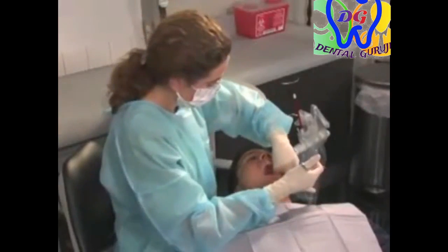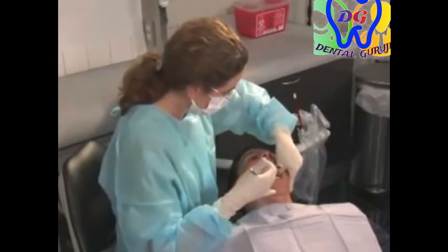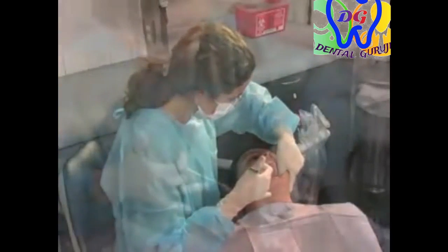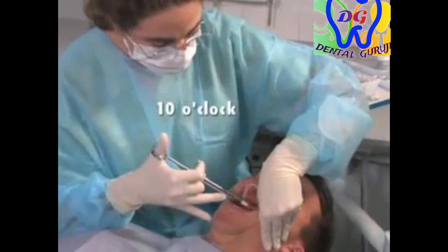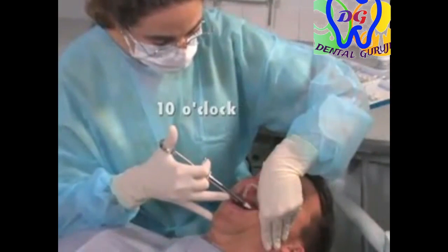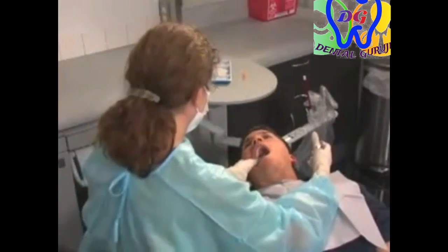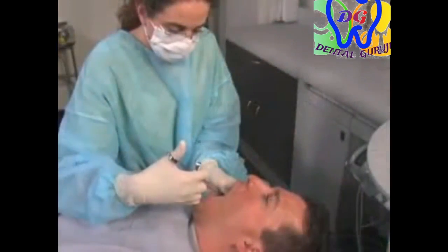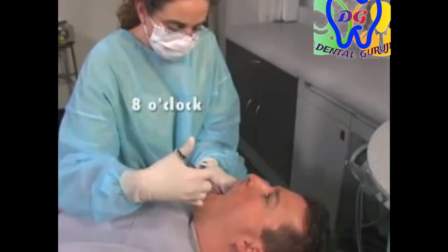For a left inferior alveolar nerve block, the right-handed operator should sit at the 10 o'clock position facing in the same direction as the patient. For the right inferior alveolar nerve block, the right-handed operator should sit at the 8 o'clock position facing the patient.